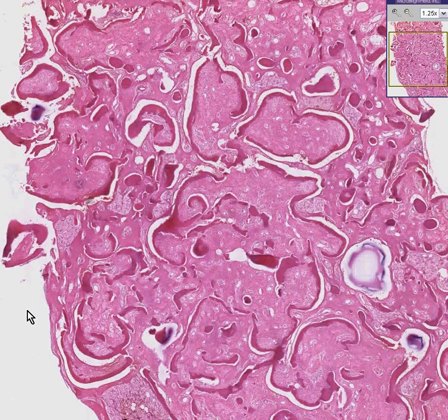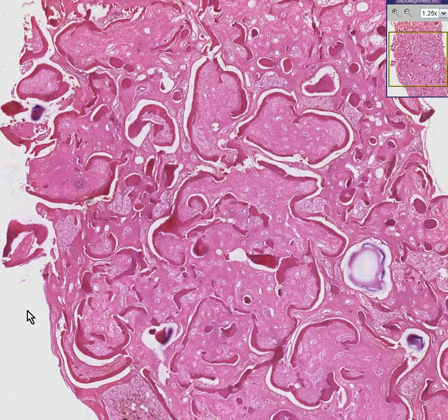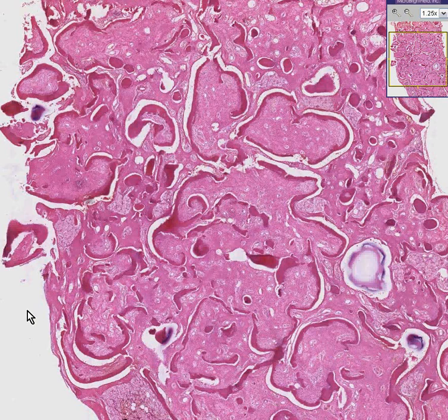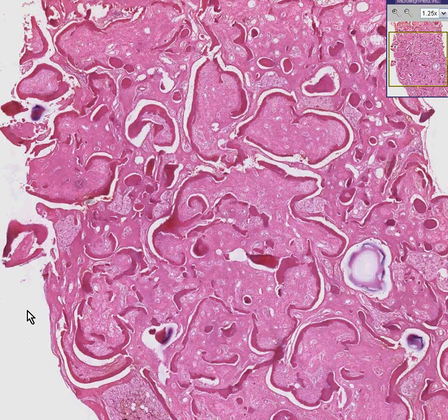I can remember an old joke somewhere along the line that said the moral majority is neither. Well, here we have a case of fibrous dysplasia. I cannot say that fibrous dysplasia is neither, but I can say it is not truly dysplastic from the malignant sense of the word.